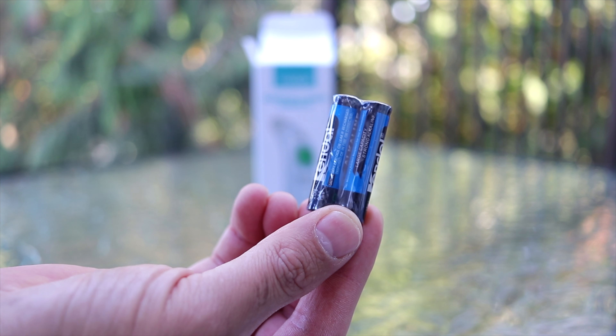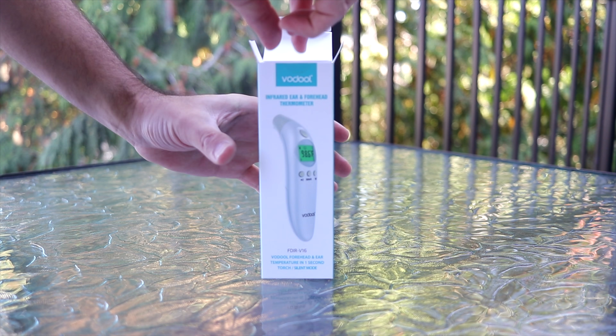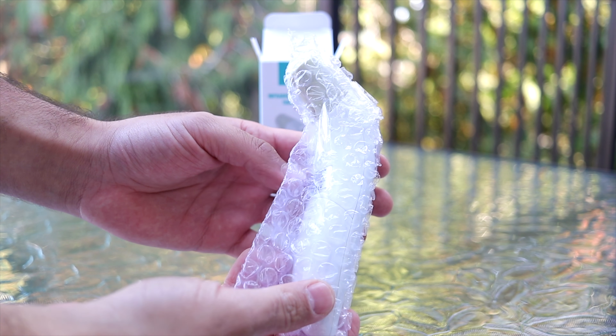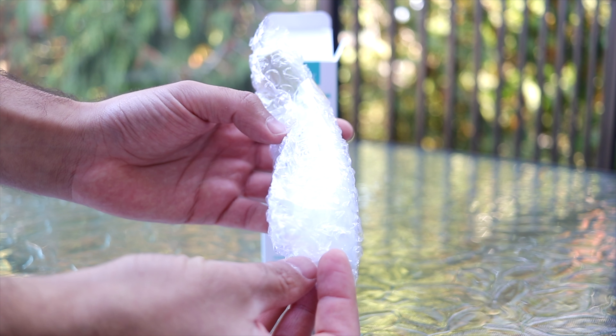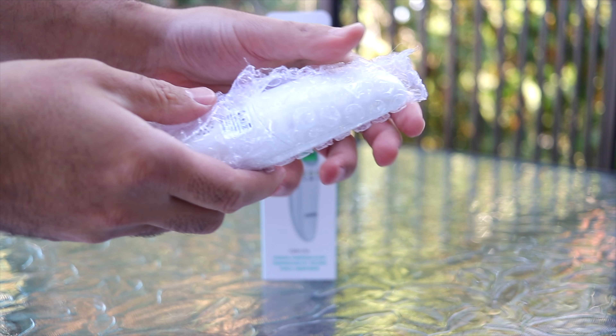First up we have two AAA batteries that are included. Next we have the thermometer itself, all nicely bubble wrapped and protected. Let's go ahead and open it up.